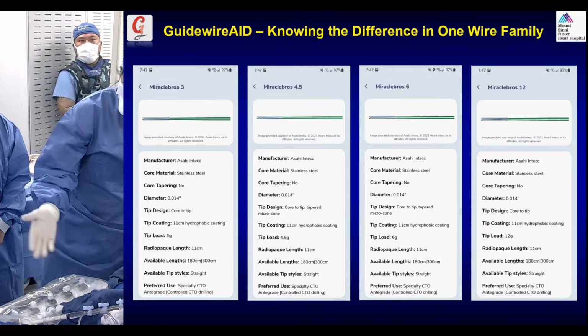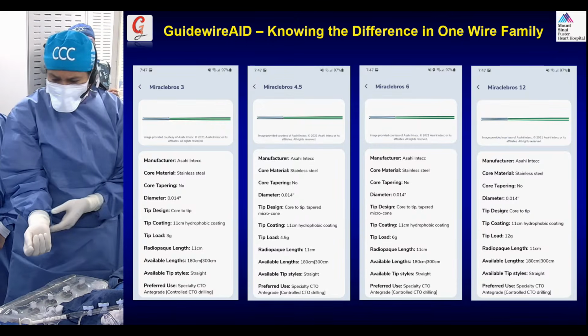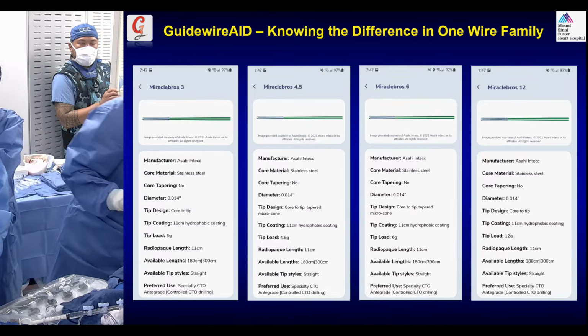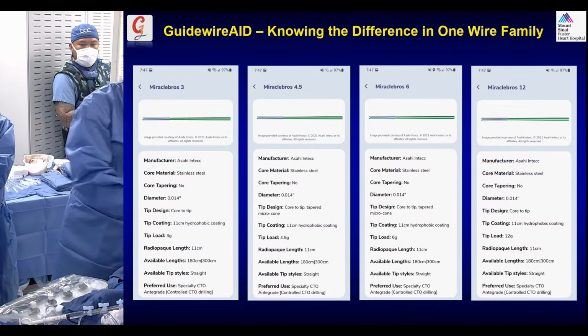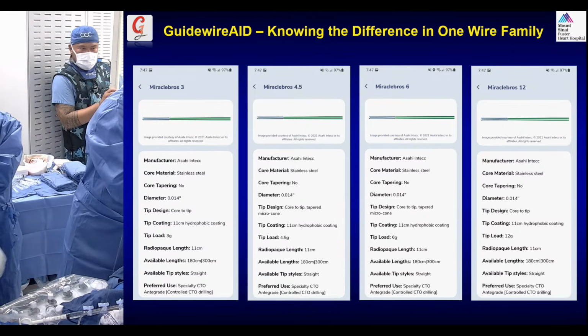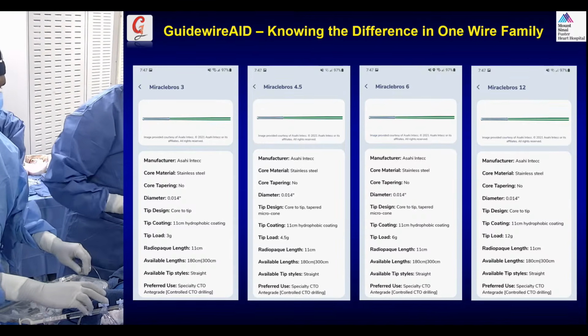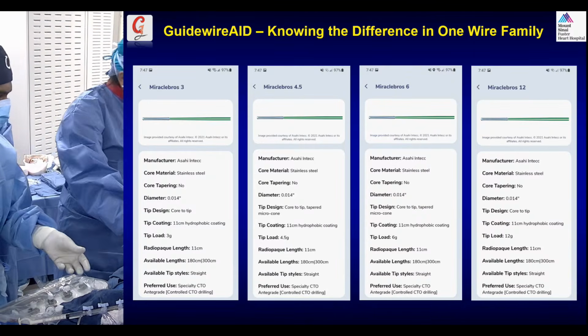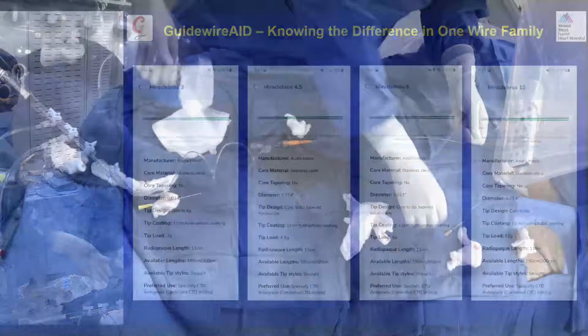So where is the wire? No, I know. Where's my wire? Yeah, I can see that. I'm trying to show them the shape. They want to know the shapes. If any of the wires are still here. So if you can show me the ceiling camera.